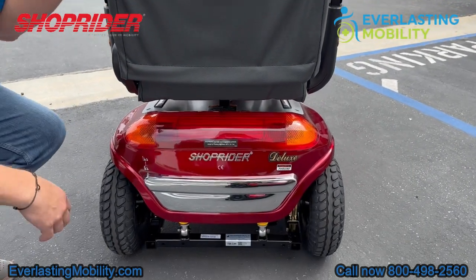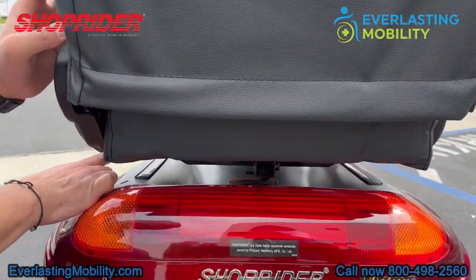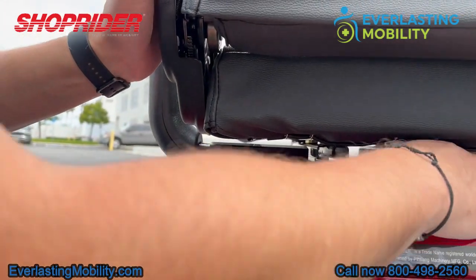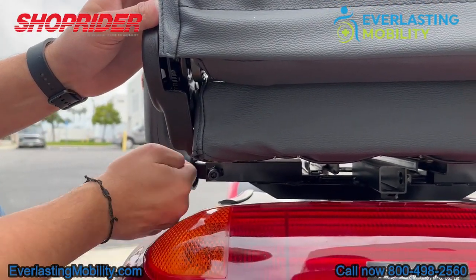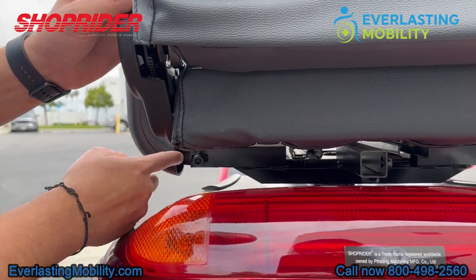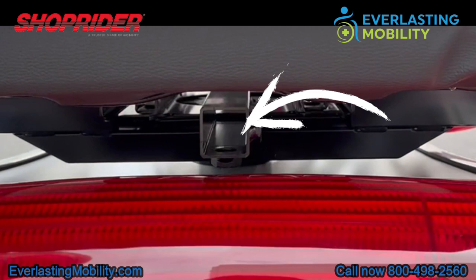On the back of the scooter, you can see there are two little holes on this crossbar where the armrests are. A tool that comes with the scooter allows you to adjust the width of the armrests. This is the accessory hitch on the back of the scooter, and with it you can add things like a rear basket or a cane holder. Just go to our product page to see which accessories are available.